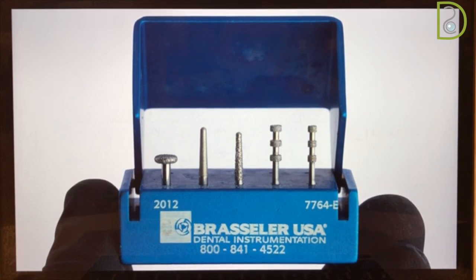So starting from the top right burr, we have the 0.3 millimeter. Very conservative preparation for the gingival third only. Next burr, 0.5 millimeter, most commonly used for middle and incisal third when teeth need a slight change in color or contour. Now, there's also 0.7 and 1 millimeter depth cutting burrs, which can be used with severely discolored teeth where we need more room for preparation. Now, the wheel diamond burr for incisal reduction, then the round and red and green diamond burrs for facial reduction.